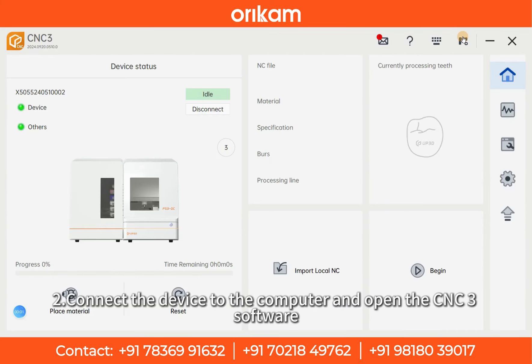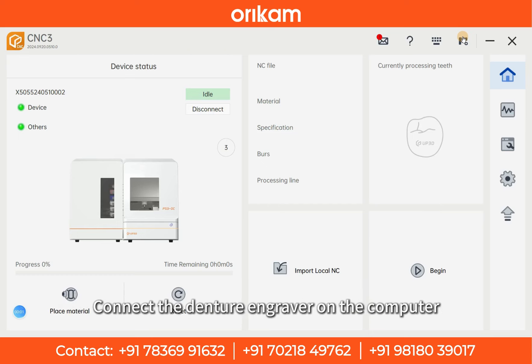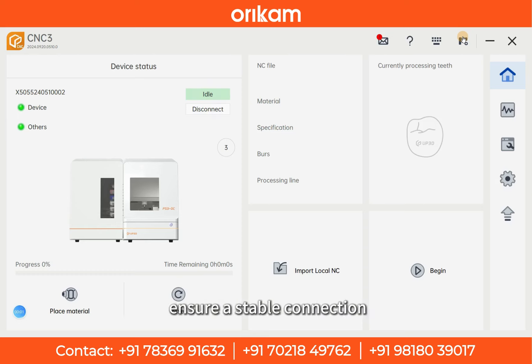Step 2: Connect the device to the computer and open the CNC3 software. Connect the denture engraver to the computer, open the CNC3 software, and make sure the device and computer are in the same network environment to ensure a stable connection.